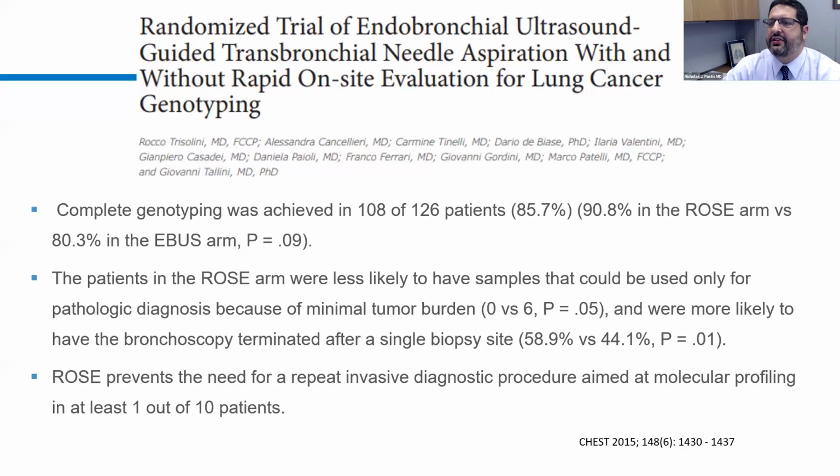There's a lot of literature, as I mentioned, that ROSE doesn't make a difference in diagnosis, and that's true. But we think that with molecular analysis, it can tell you, I'm getting a cellular specimen, I'm going to stay here and get more from this lymph node. It can shorten the procedure. In this study, at least, it was more likely to be terminated after a single biopsy site.